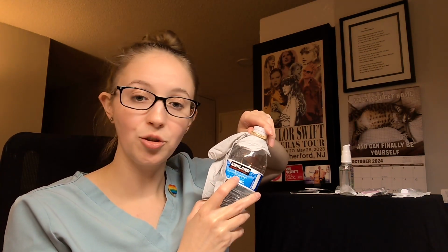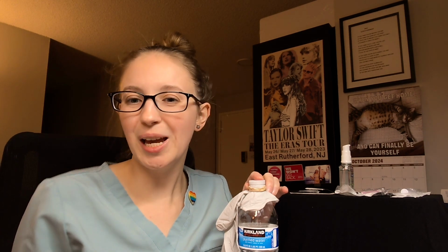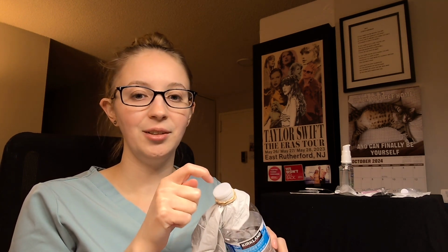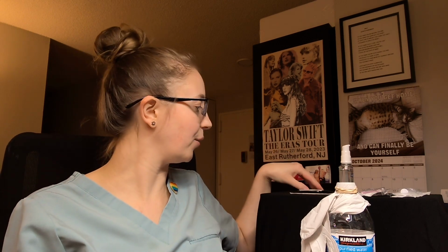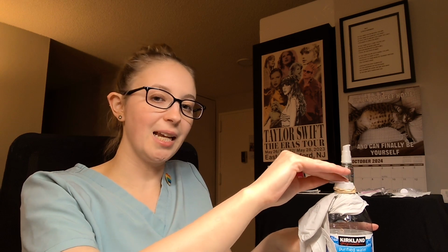You're going to want to confirm the name of your medication, the concentration, and that it's not expired. The concentration is important to know so that you draw the correct dose, like we calculated earlier. Once you've confirmed the name of the medication, and that it's not expired, you can go ahead and pop off this firm plastic top like that, and that's going to reveal a smooth rubber top. You're going to go ahead and grab one of your alcohol swabs, and you use that to clean off the rubber top of the medication vial.